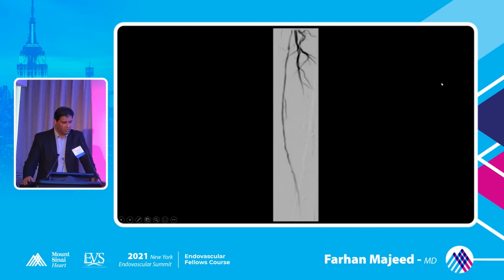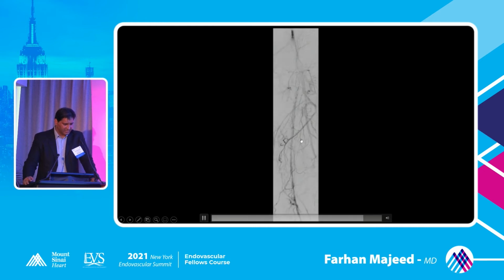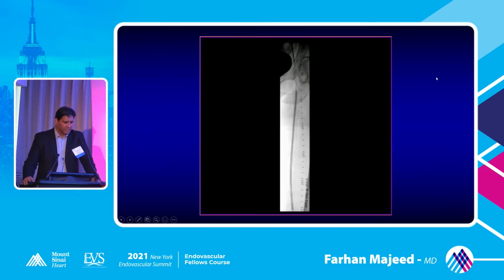Okay, so we're getting some increased luminal gain here. My time is getting shorter. But you can still see there's a lot of disease up here, right? So at that point, we did PTA of the proximal segment and DCB of the in-stent segment.